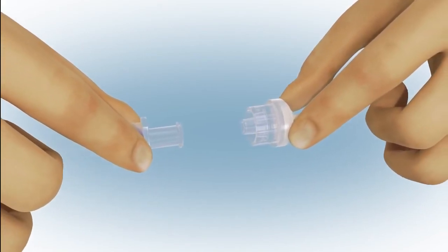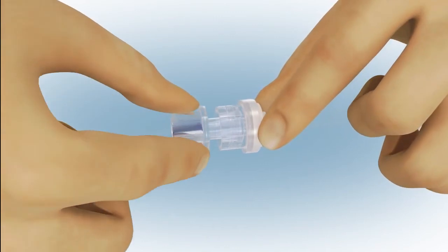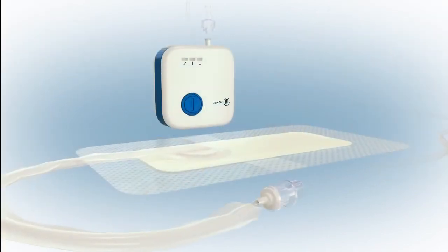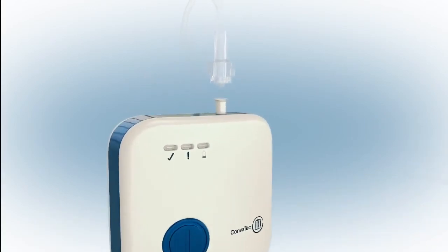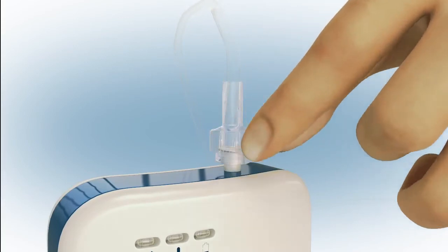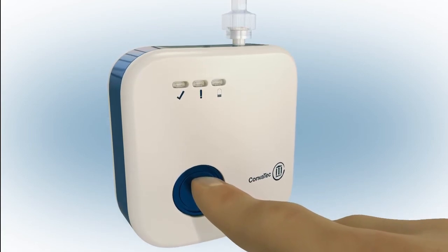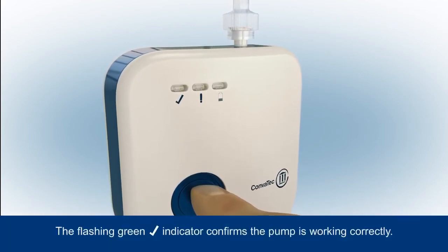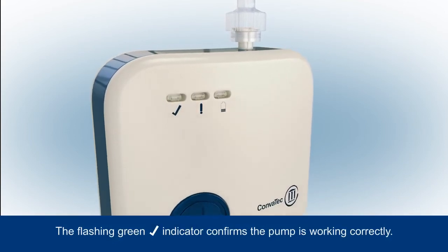Connect the dressing to the pump by twisting together the connectors to ensure a secure connection between the dressing and pump tubing. If a shorter connection is required, the pump tubing can be removed and the dressing connected directly to the pump. Press the blue button at the front of the pump for three seconds to commence negative pressure.